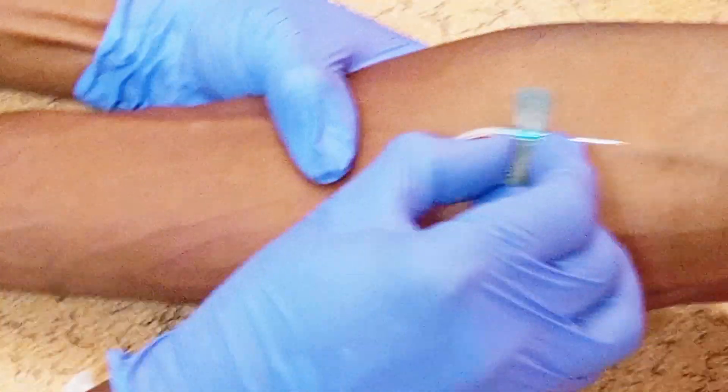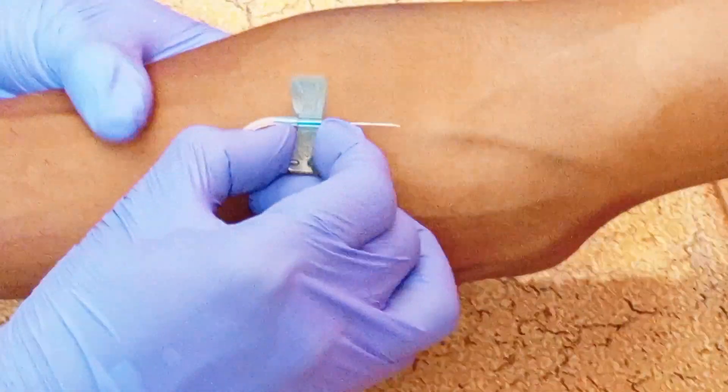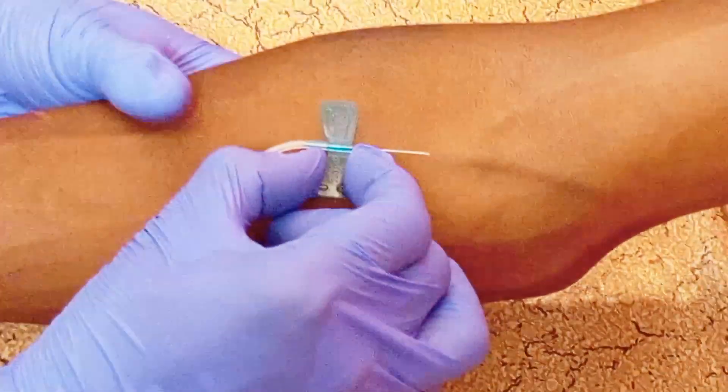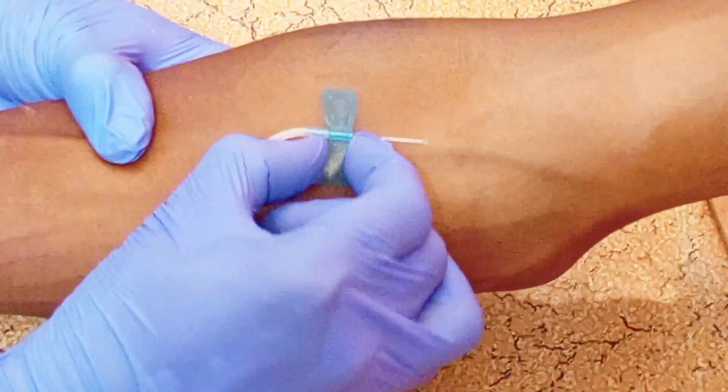Attach the butterfly needle to the syringe and ensure that you remove any air bubbles from the syringe. Then insert the needle at a 15-degree angle into the vein.